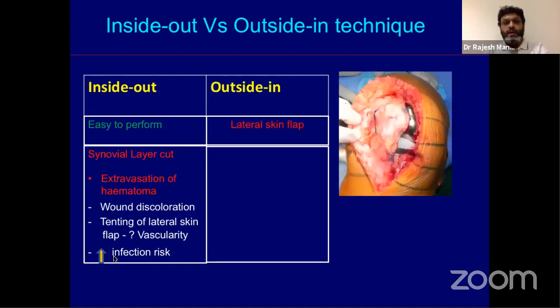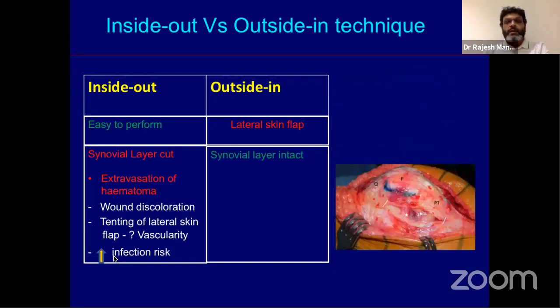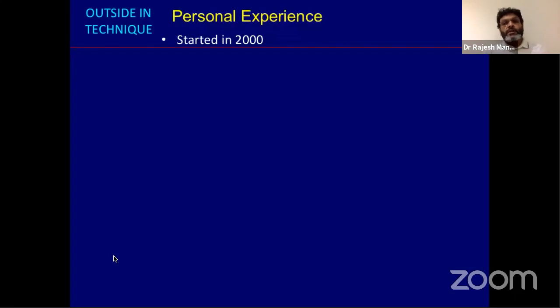Whereas the outside-in technique, which is what I use, although you need to raise the lateral skin flap, it's a very tiny one, and most of the time in the exposure, you've already done that. The important thing is that it leaves behind the synovium layer intact. As you can see here, there is no extravasation of blood, no intra-articular blood that collects post-operatively, and therefore it is a safer thing to do. I started using this technique in 2000 and have modified it and have been using it since for all my patients.